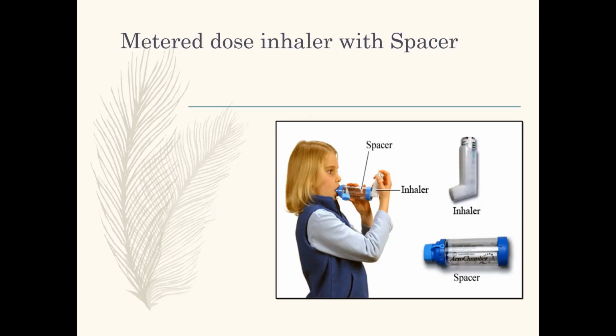If the client's not using a spacer, let's say they're just doing the metered dose inhaler, no spacer, these are the steps the client's going to take. They're going to take a deep breath in and exhale. Then they're going to place the inhaler mouthpiece directly in their mouth, securing it with their teeth and sealing around it with their lips. They're going to inhale slowly and deeply through their mouth as they depress the canister. Once they inhale all the way, they're going to hold their breath for 5 to 10 seconds, take the inhaler out of their mouth and exhale slowly through pursed lips.